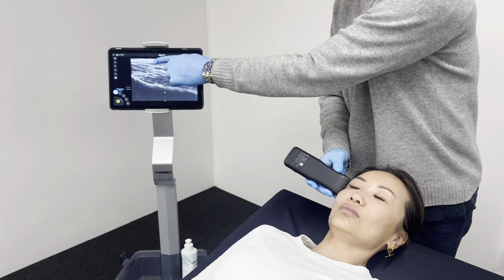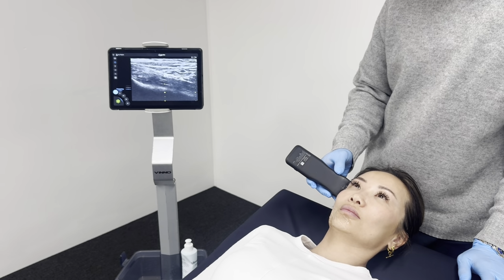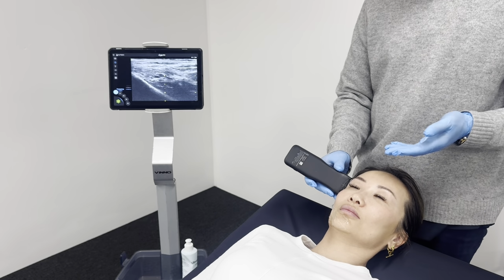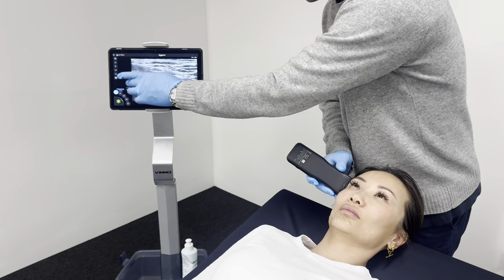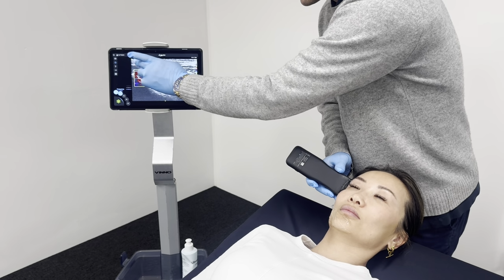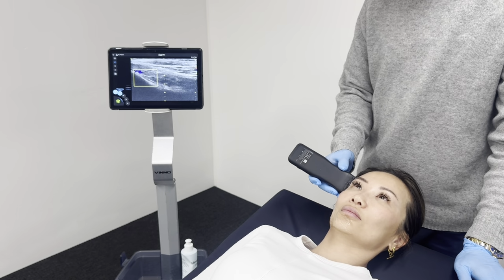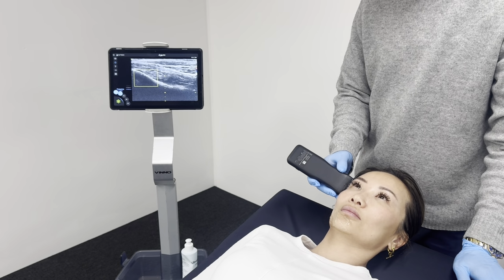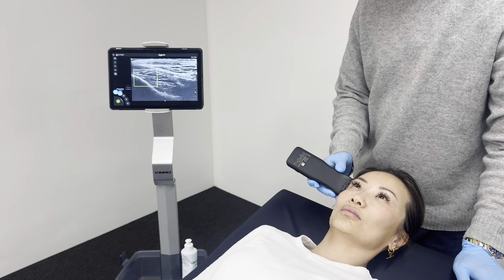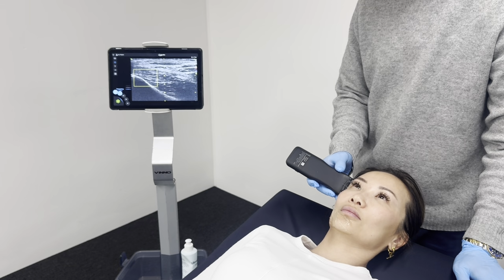the fat above it, and we can see the superficial temporal fascia as well, the white lines at the top of the screen there. And then if you want to have a look at where the arteries are in relation to the bone, we can put the colour flow on. And usually we check down here. I'm just going to decrease the gain of the colour because it's a bit too much. And let's have a look and see if we can find those deep temporal arteries. There it is. So that's that anterior branch of the deep temporal artery that we're seeing just above the temporal bone there.